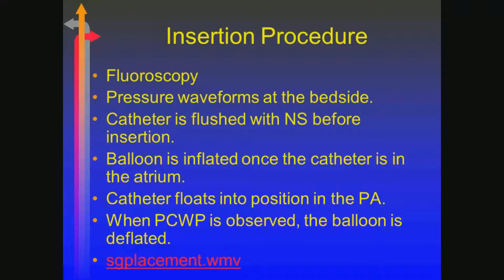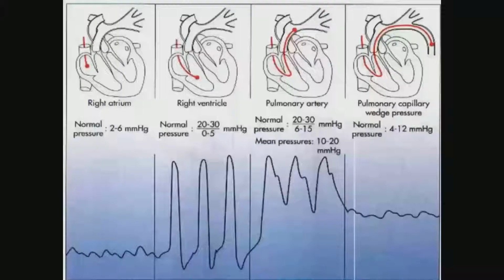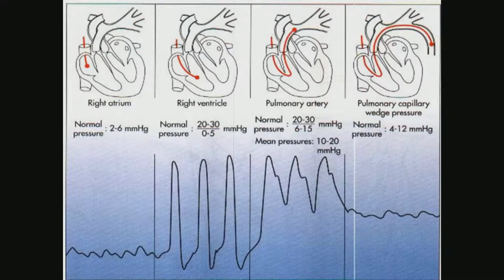So we prep the catheter by putting some saline in it. We test the balloon, and we just watch it as it floats in. The balloon is inflated, so it's in the right atrium, and we have a CVP pressure. Once it crosses through the tricuspid valve, I now see a ventricular tracing with a higher systolic and a well-defined diastolic.